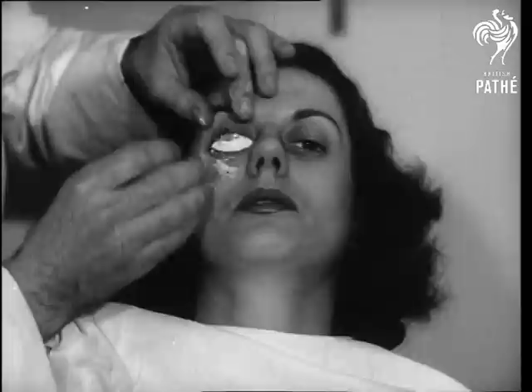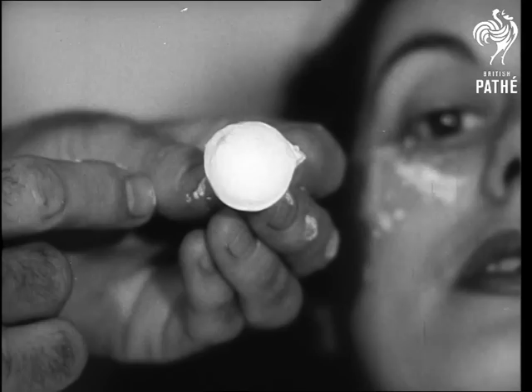A perfect impression. Contact lenses are worn by actors, several film stars, jockeys, and athletes. Yes, even glasses are made to measure today.